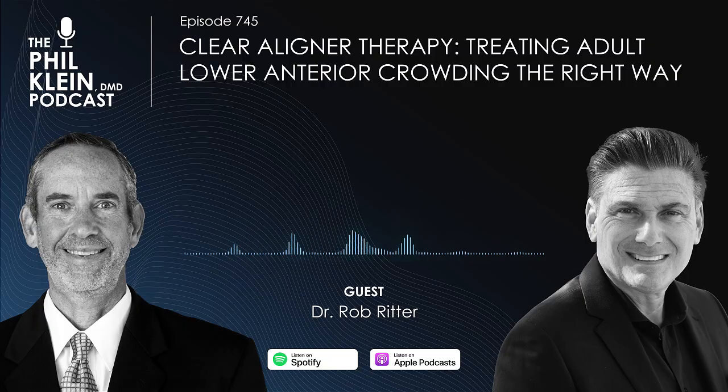I have no problem with IPR. IPR is needed in a lot of cases. With the systems that are set up now, with the different types of materials that we have, to either use strips or different finishing burrs that can get in there and do the IPR. I explained to the patient we're going to remove a couple of hair thickness of the teeth and then IPR the teeth. There's no problem with IPR.